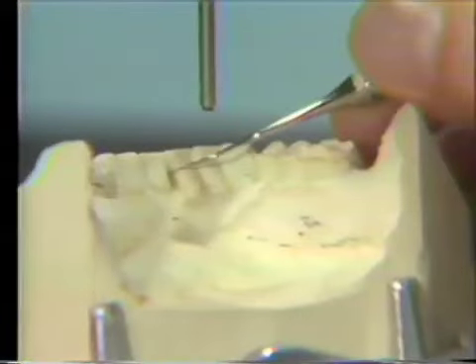I'm going way around to the buccal surface, and I can't duplicate that any place. Maybe I could, if I use this bicuspid area, I could use the cervical of that right there to reposition it. I'll see if I can find anything better. Let's see if I need 3 points widely spread.